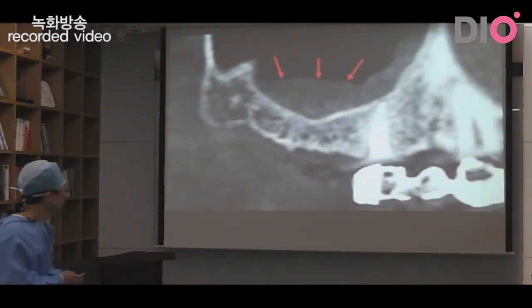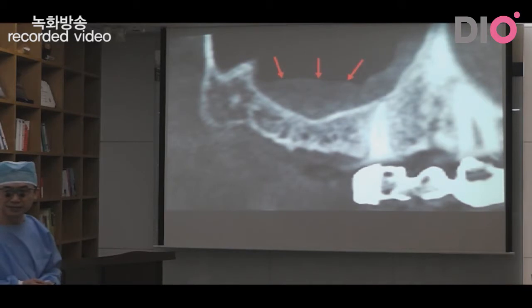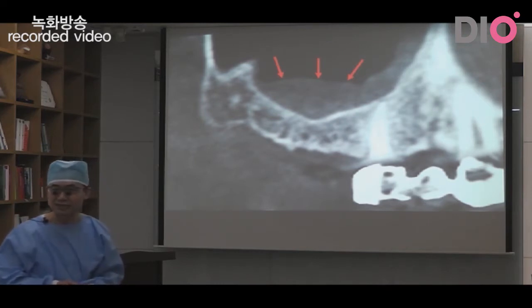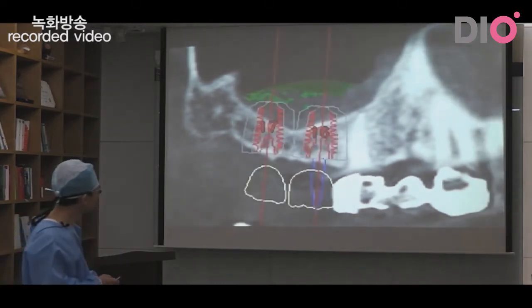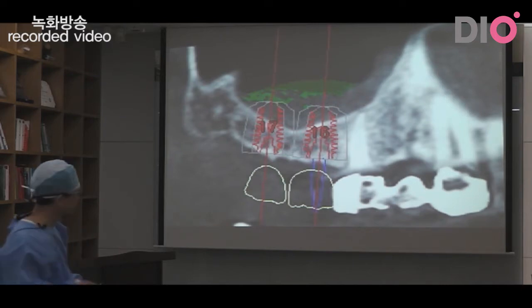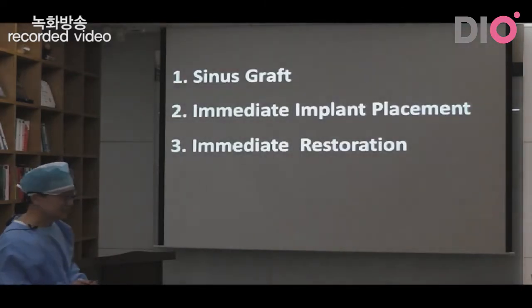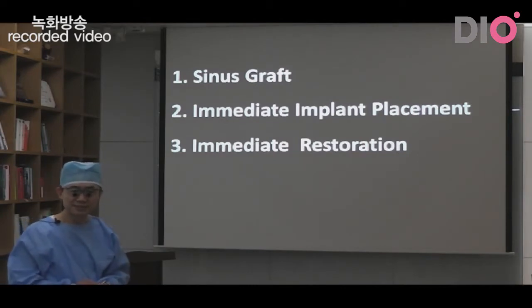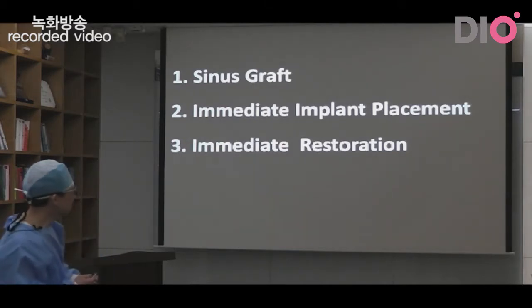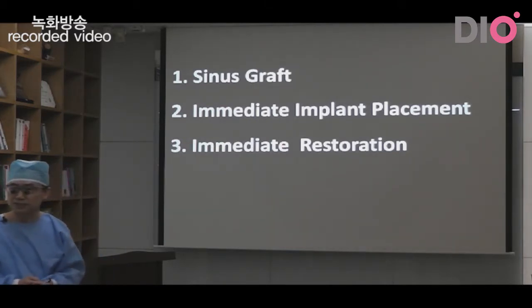You can see here the thickened mucosa in the sinus cavity. I'm going to lift the sinus membrane even though it is thickened. After lifting the sinus membrane, I'm going to put sinus graft material in the cavity. The procedures that I'm going to do today are sinus graft, immediate placement of two implants, and immediate restoration.